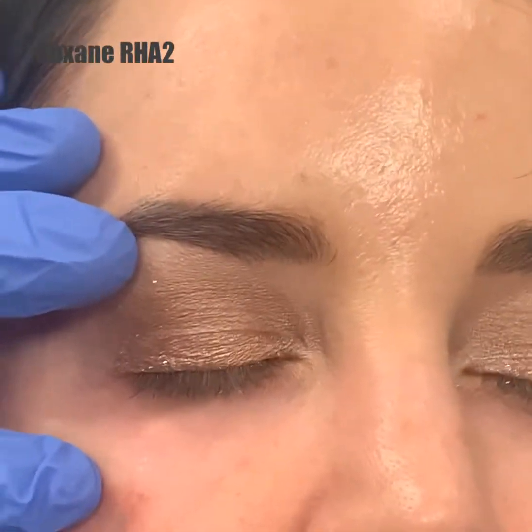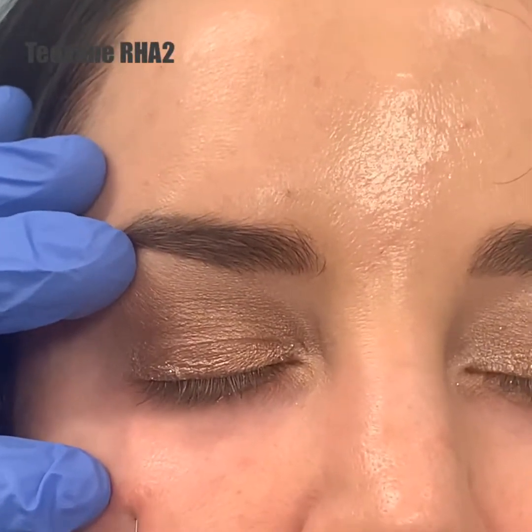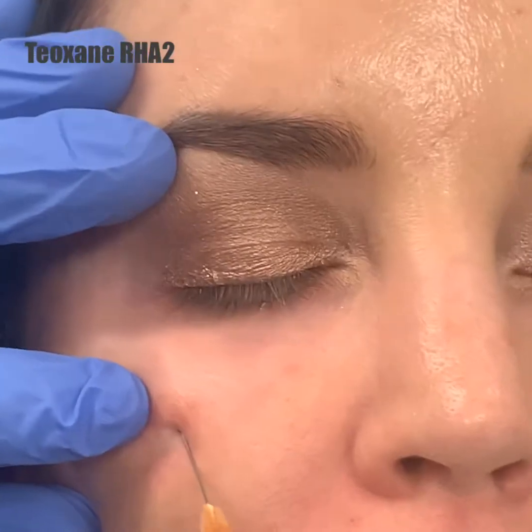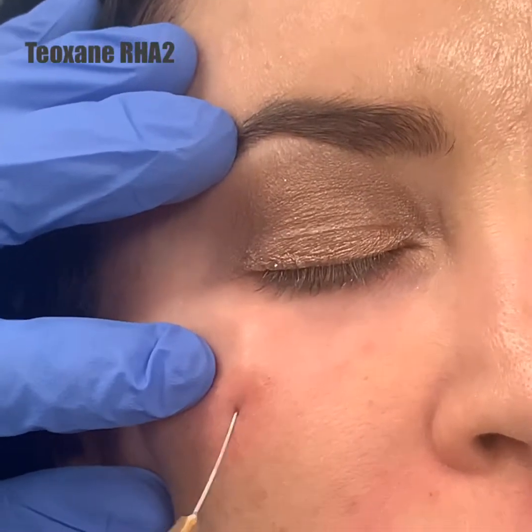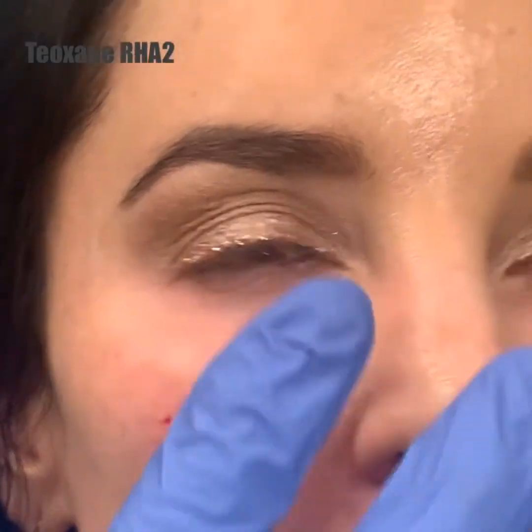So we're going along, putting a little bit of product, first medially next to the nose, then we do under the eye, and then a little bit lateral in this groove out to the side of the eyelid orbit. And you can feel as this product is being injected, it's very smooth and very easy to control. And then we will do a little tiny bit of molding to make sure that everything is nice and even. She'll put a little pressure on this area while we go to the other side.